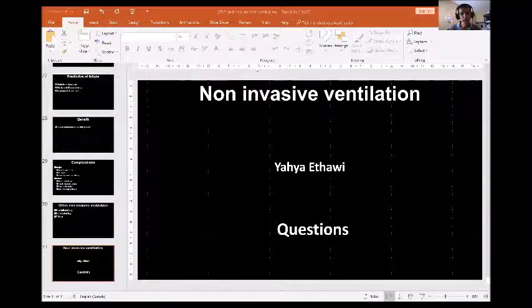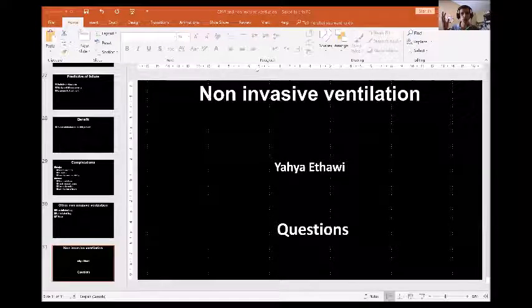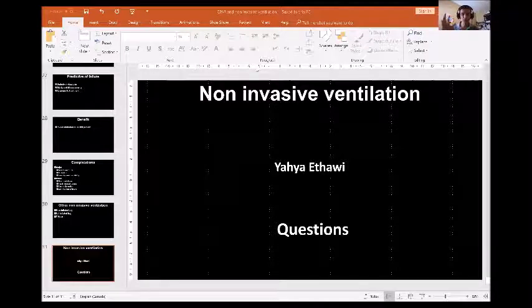How can you calculate CPAP in the machine? You just set it. If you don't have the pressure, you look at the flow. Usually the CPAP level is the flow minus 3. So if you have a flow of 9, usually your pressure is 6. If your flow is 10 liters per minute, usually your pressure is 7. But that's a gross estimate.